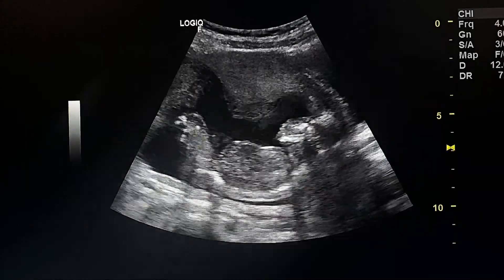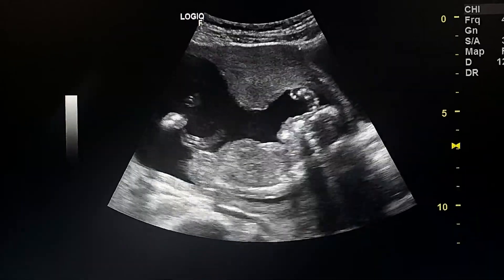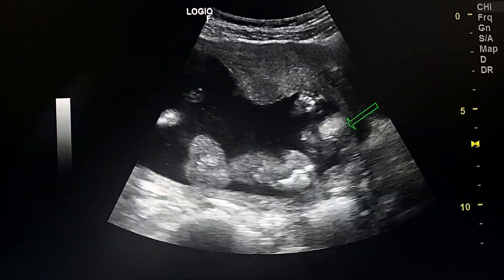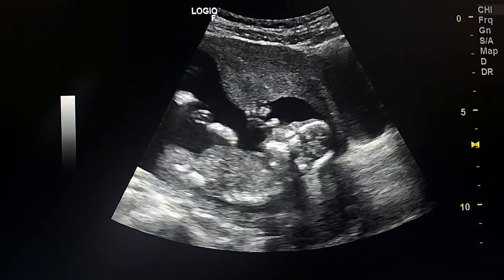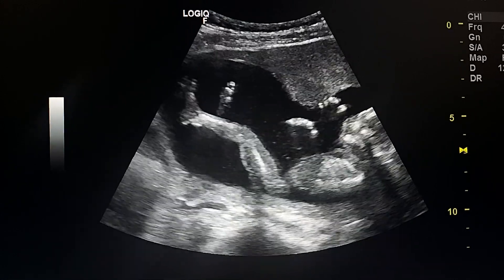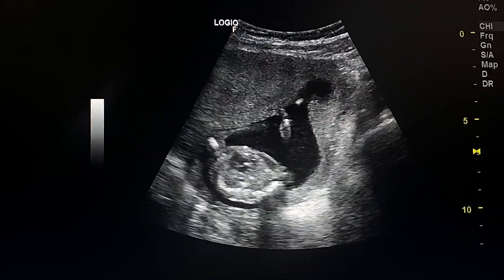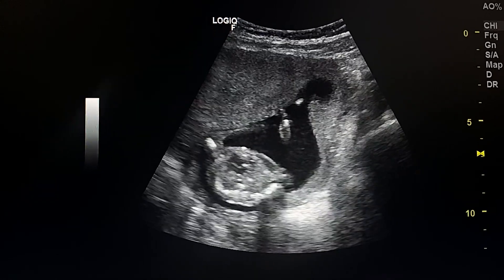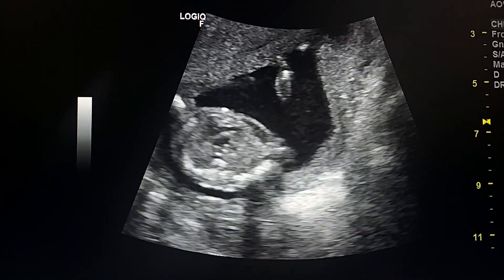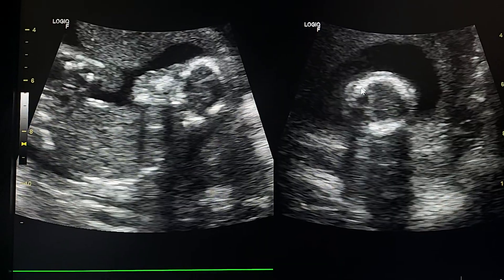This is an ultrasound exam of a fetus with microcephaly. Here we see in this sagittal view a small cranium. The extremities are normal, and looking at the heart, we don't see a four-chamber heart. This is the axial view.